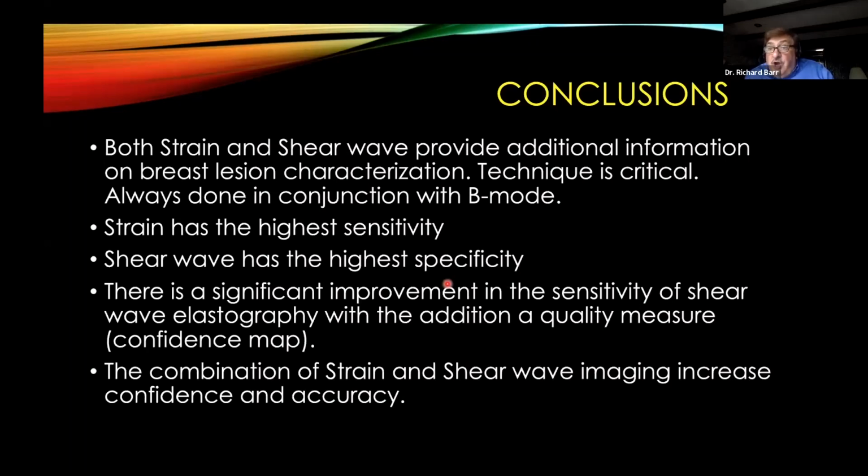The 2D we always use because we have the big field of view and we can see the variability in stiffness of the lesion, and find the stiffest area to do our measurement. The cutoff values would be the same for point shear wave and for 2D shear wave, but it's very, very difficult to find that stiffest area accurately when you only have point shear wave.